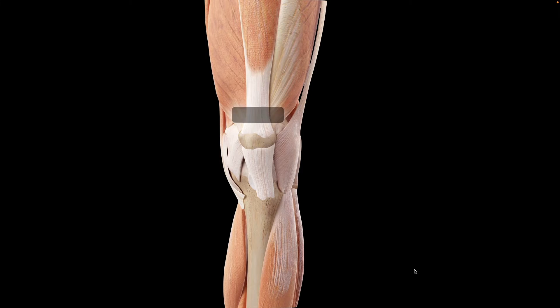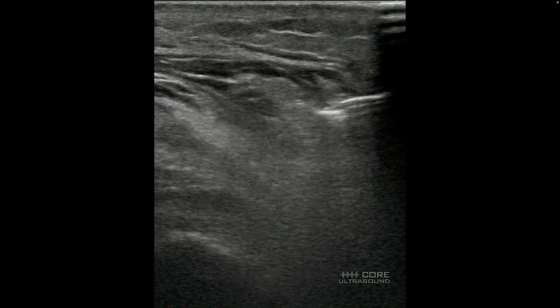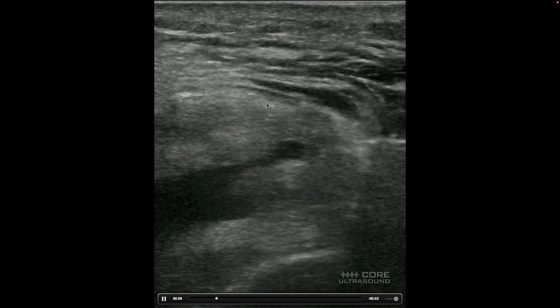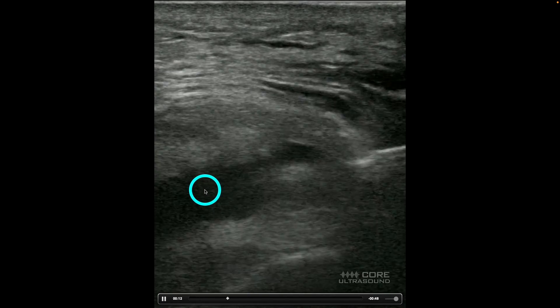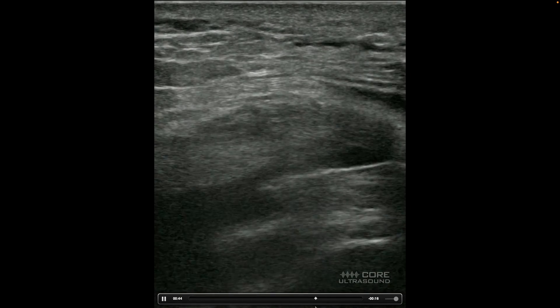One thing I want to mention is that when you place your transducer on the suprapatellar recess and you're coming at it laterally, sometimes where you have your transducer and where you're actually doing your initial puncture into the skin are not going to be close. So what you do is move your transducer out laterally, find the needle, and then guide it back towards the space. This right here is the needle tip, and right here is that bevel. I actually moved my transducer laterally to find my needle and guide it to the pocket. My needle is going to advance and I'm going to move my transducer from a lateral to medial orientation, guiding it to this fluid pocket to aspirate this knee effusion for suspicion of septic joint. There I'm getting into that joint space and able to aspirate.